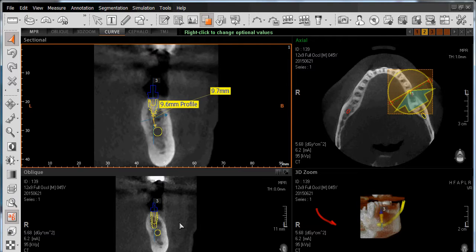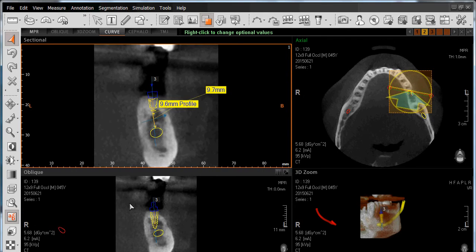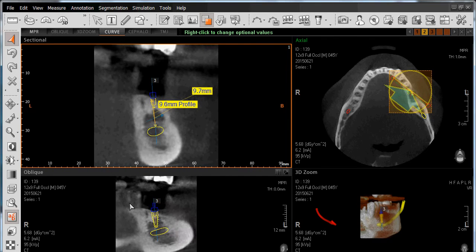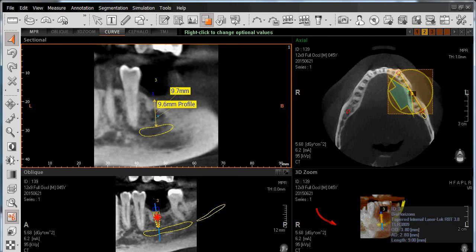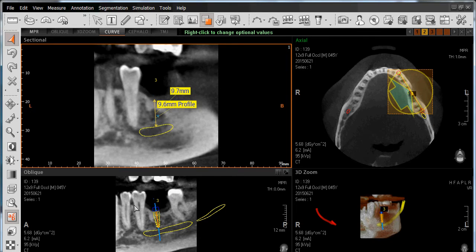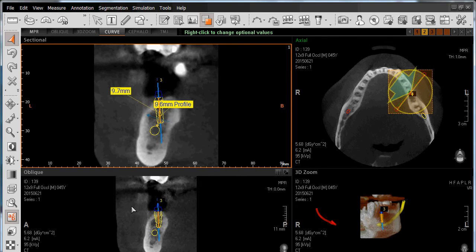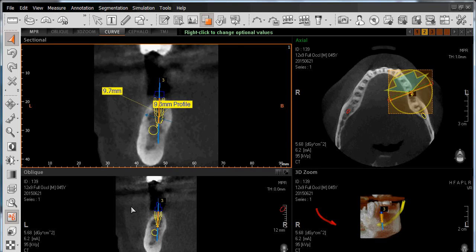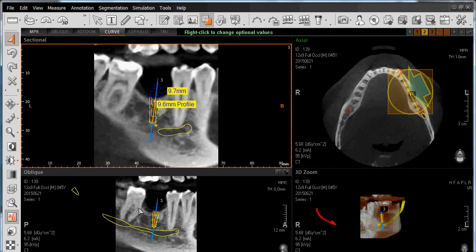To rotate around this implant, simply position the mouse on top of our oblique view and use the center wheel of your mouse. As you scroll either towards you or away from you, you'll note that the arrow in the upper right-hand corner goes around counter-clockwise. You can stop when you get to the lingual aspect and assess the placement of your implant, make an adjustment to align accordingly. Continue using the scroll wheel to generate a view looking anterior-posterior, and then continue scrolling around to the buccal aspect to identify placement between the adjacent teeth.